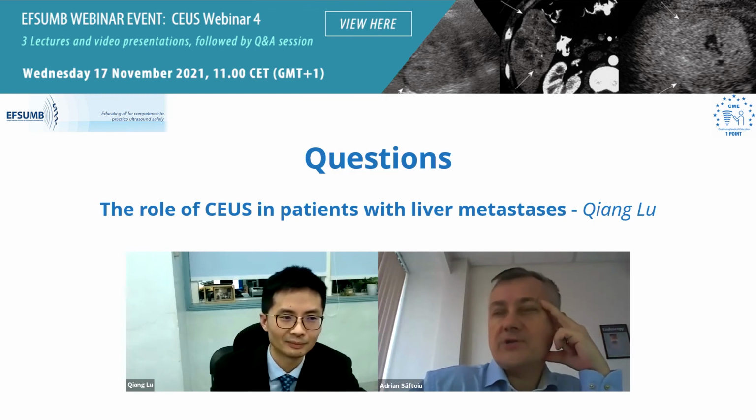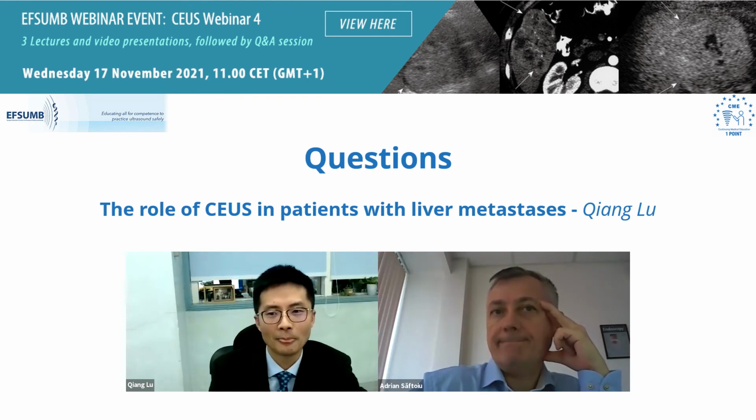There's one more question. Is it with Sonazoid or with SonoVue, your experience in intraoperative ultrasound? In our hospital, we use SonoVue. Maybe we'll try Sonazoid in the near future.